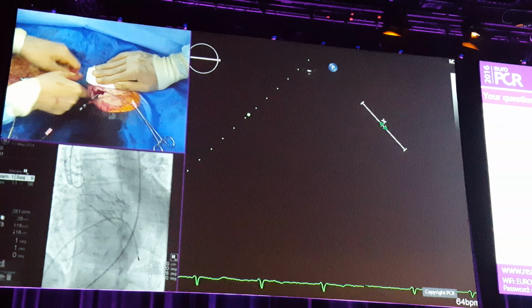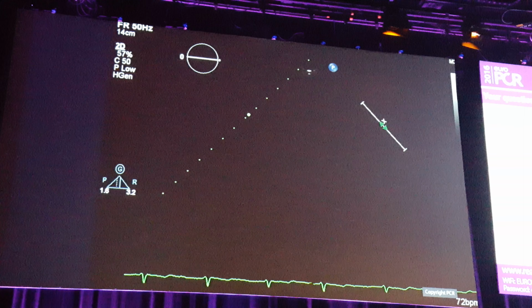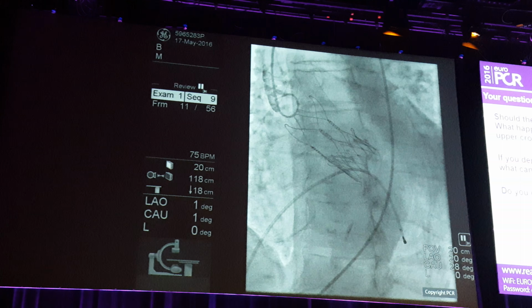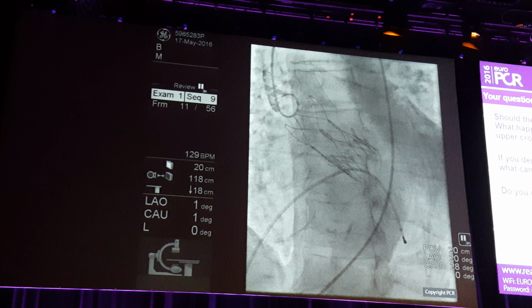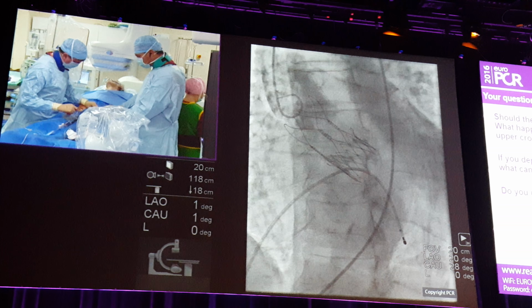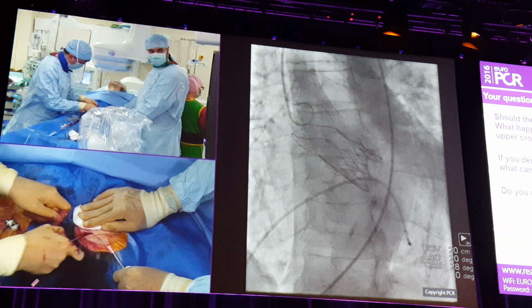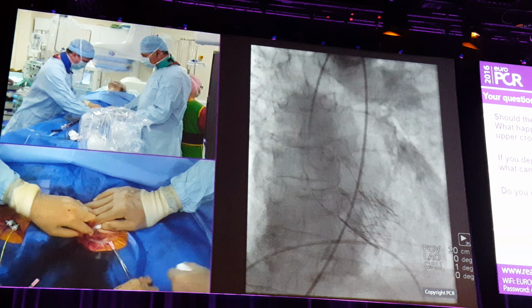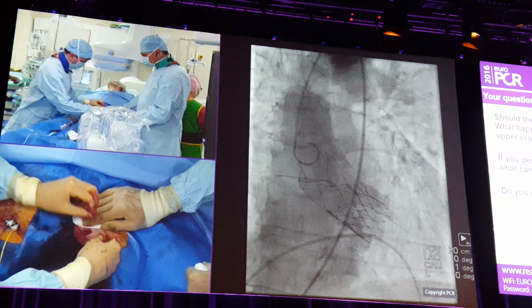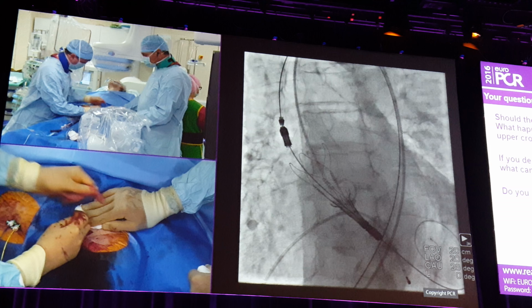Could you, Simon or Bernard, show us the implantation clip again, that you let that clip run? It's really important. Of course. Yeah, we put the implantation. I believe you need to find the right position. Too low is a problem. You need to avoid it. But once you have the right position, you're very safe, straightforward, and have a very intuitive, easy implantation. In some cases, I had a little bit higher implantation.